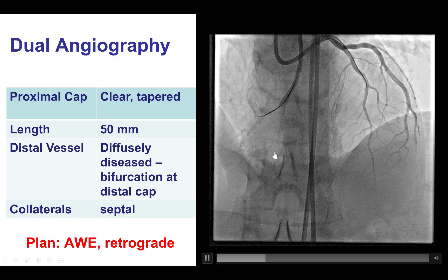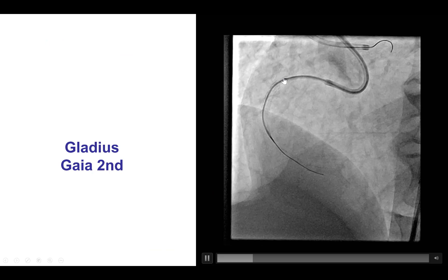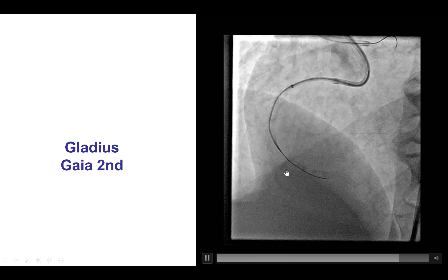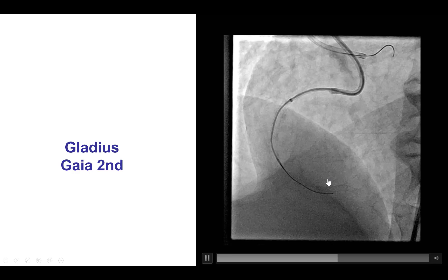Antegrade wire escalation was done with an AL1 guide, guide extension, microcatheter, and several guide wires — Gladius and Gaia 2nd — but unfortunately the guide wires entered the subintimal space. They are clearly outside the previously placed distal right coronary stent.